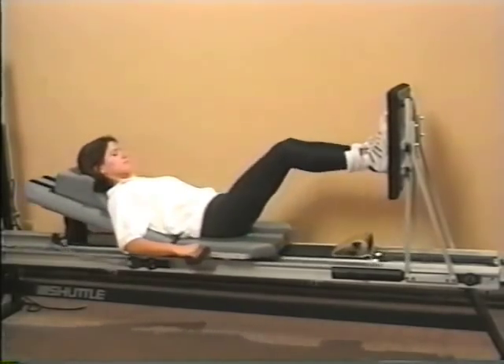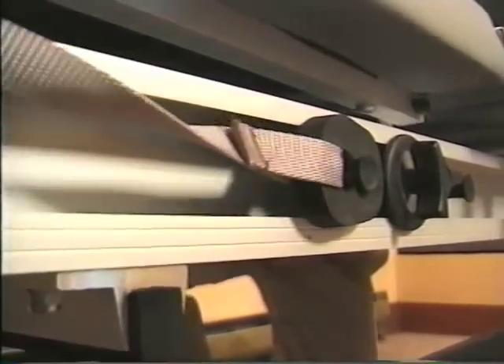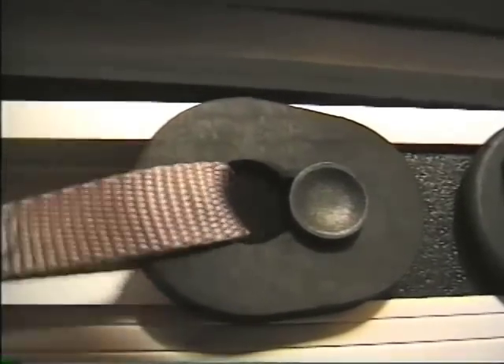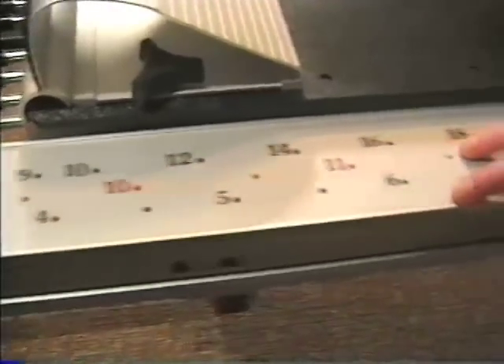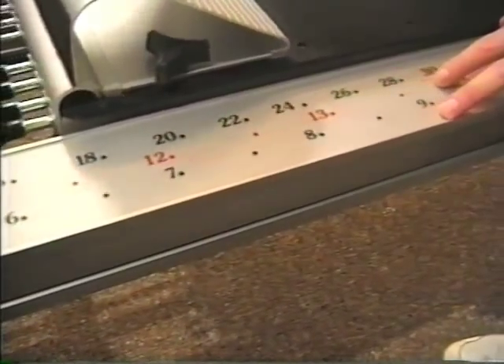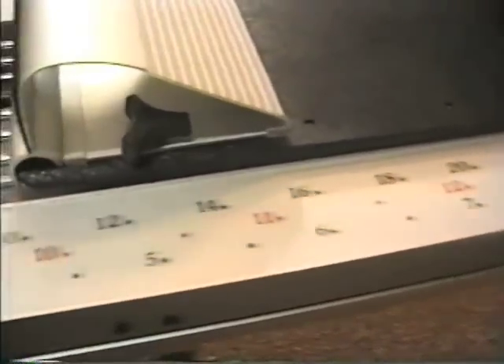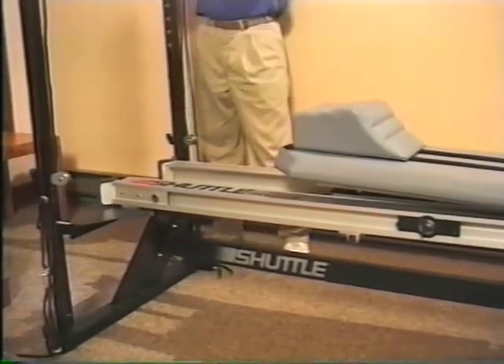Notice that these rings allow a slight bit of give, which will soften the stop if the end of the stroke is reached too abruptly. For objective analysis, the progress monitor strip will assist you in quantifying and tracking your patient's progress in terms of range of motion or distance traveled and weight bearing ability as reflected in resistive force.